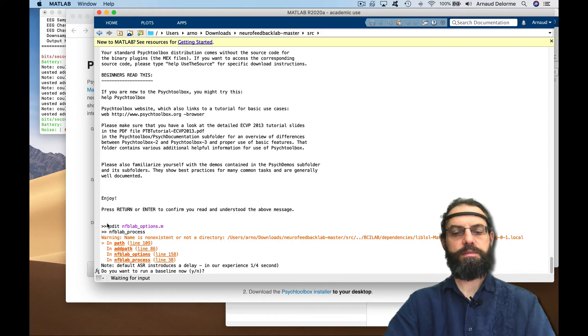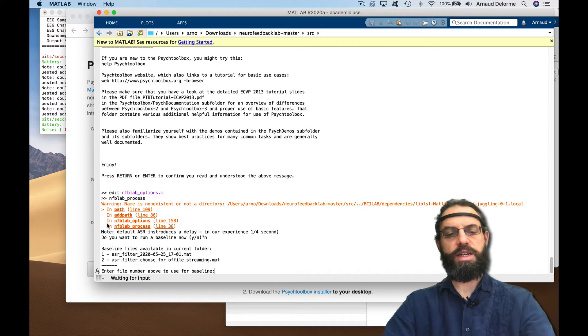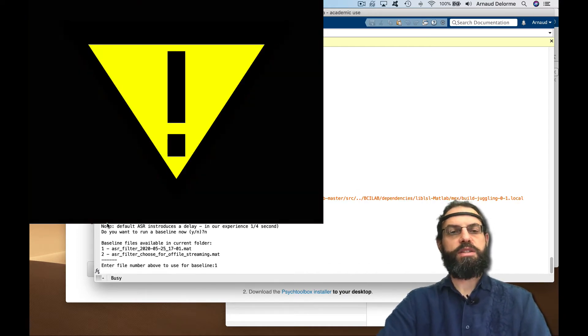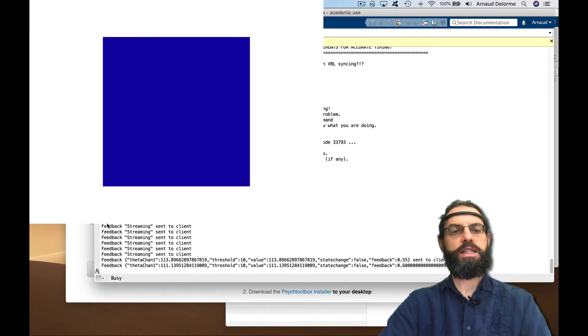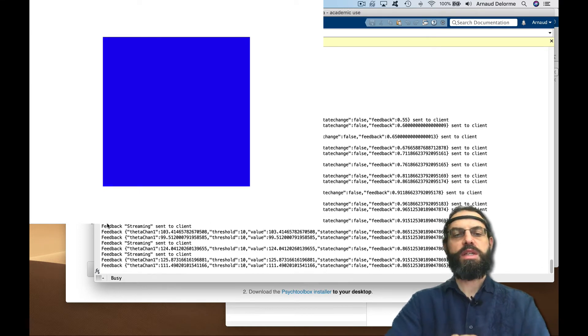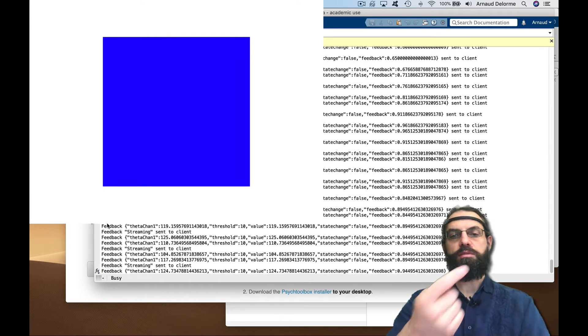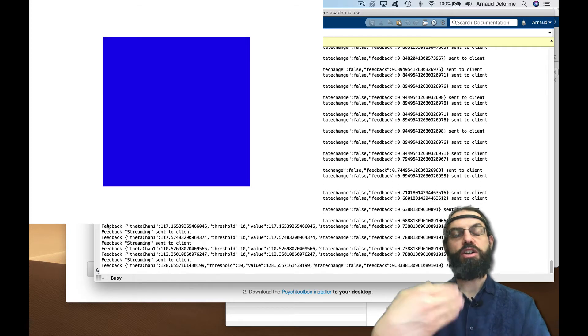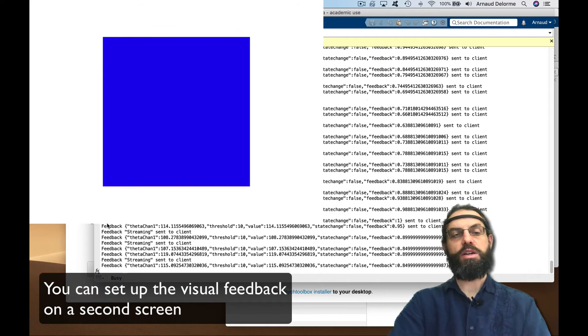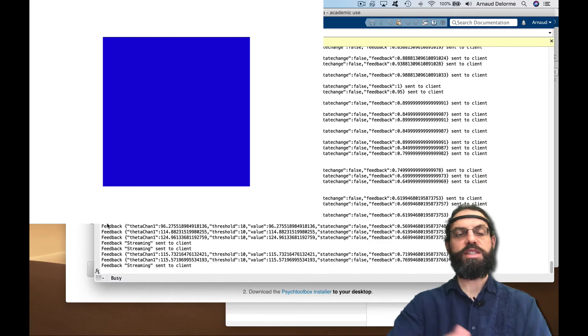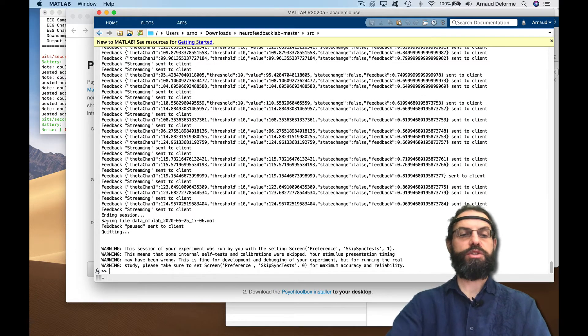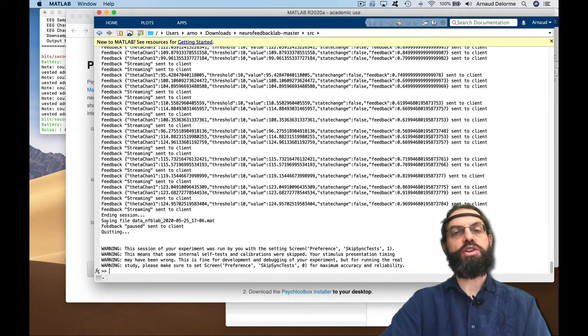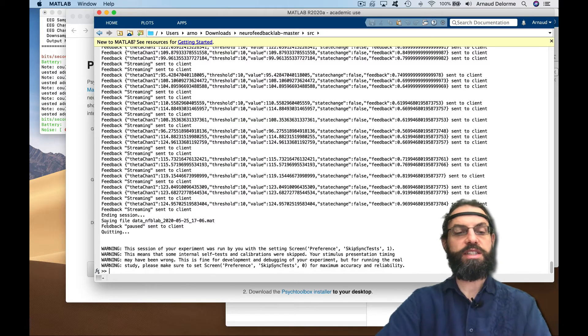Now we're going to stream again. We don't need to record another baseline, so I'm going to use this command again. Do you want to run baseline? No. Then select the file, your first file. Now it's setting up my screen with the psycho toolbox. Basically, now the color of the square depends on the spectral power. We're publishing a paper with this method which we used on 24 subjects, 8 sessions each, 192 sessions. This is a real protocol in which subjects were trying to change the color of the square, and the color was depending on the spectral power.